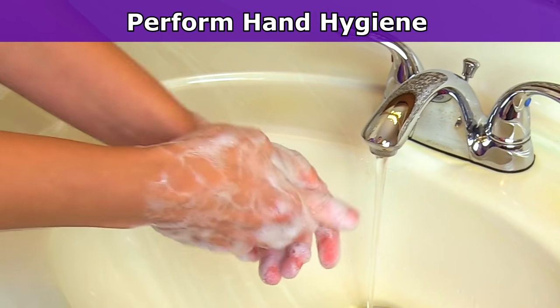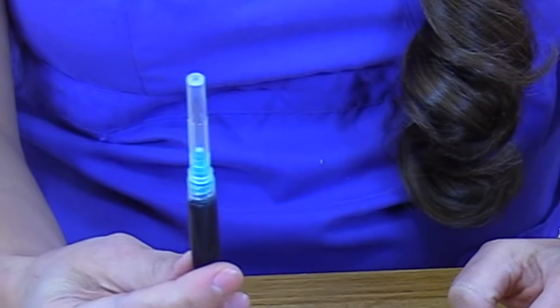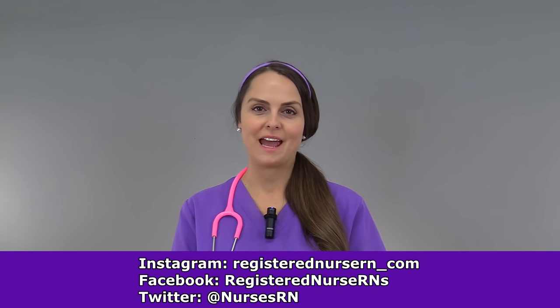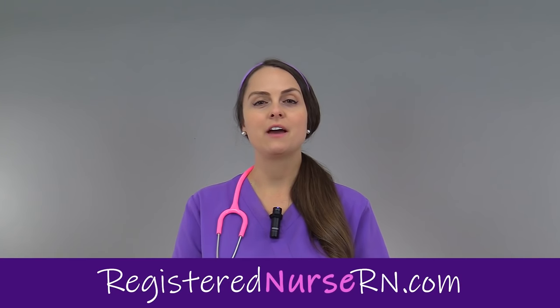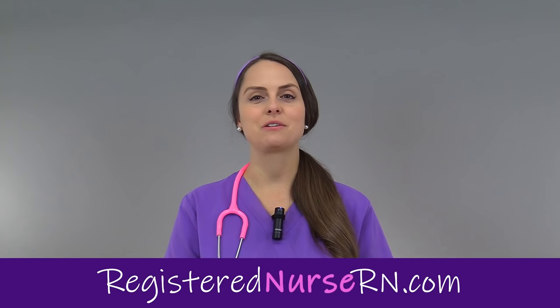Perform hand hygiene, double-check everything again, and then administer the medication. That wraps up this video on how to withdraw a medication from a vial. If you'd like to watch more videos on other nursing skills, you can access the link in the YouTube description below.